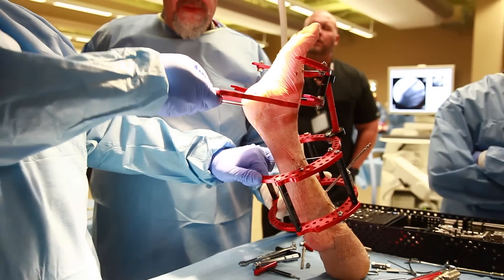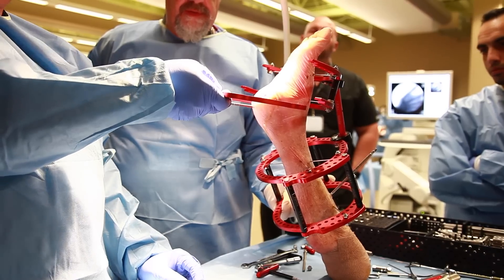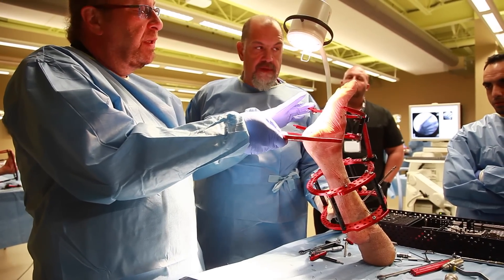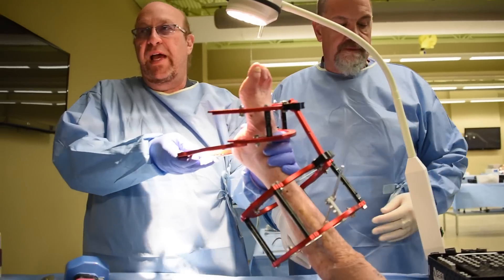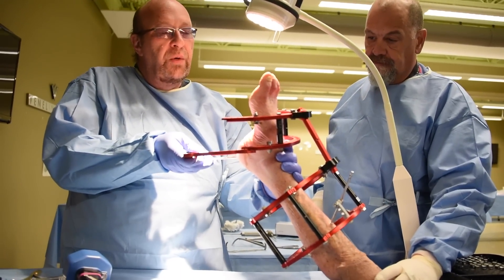So what we're going to do now is put this in whatever position I want, and my assistant will crank it down when I get it into position — and pretty much at that point we're done. All we have to do is connect it here, and there are various ways we can do it. This will actually relocate the posterior facet. The only thing you have to do is add another wire on the lateral wall of the calcaneus in order to bring the lateral wall in.